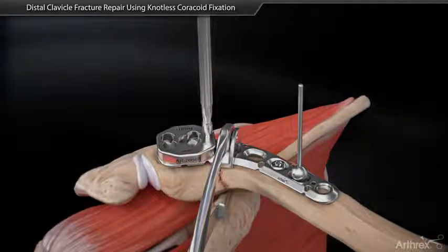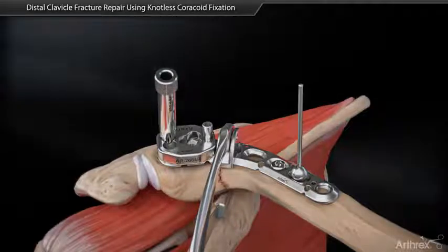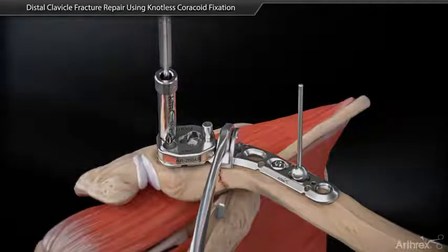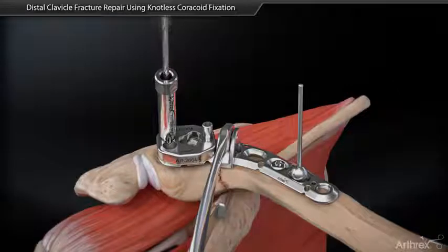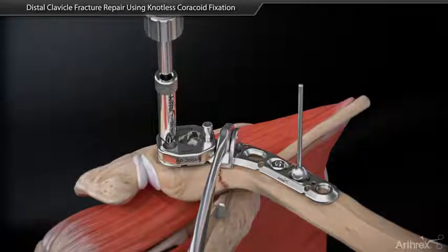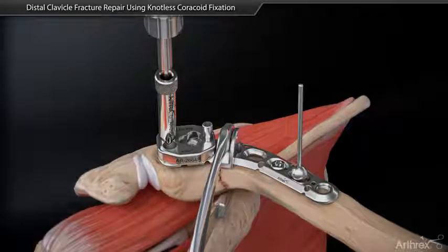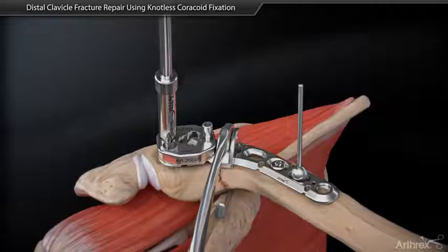Measure for screw length and drill a bicortical hole. Thread the distal drill guide into the plate and insert a guidesleeve. Leave the guidesleeve in place and drill a bicortical hole. Measure for screw length and insert the screw through the guidesleeve until it seats flush into the plate.